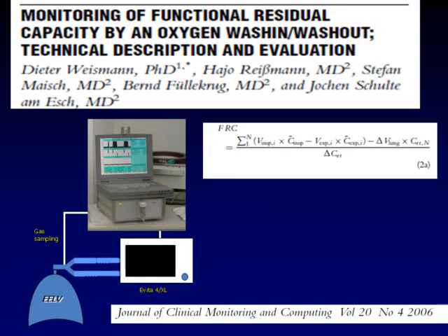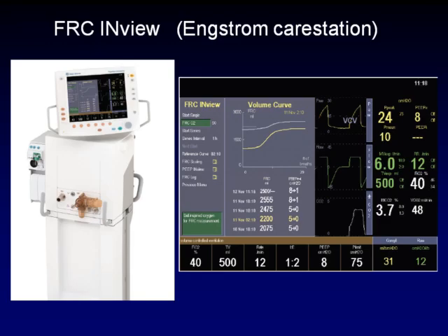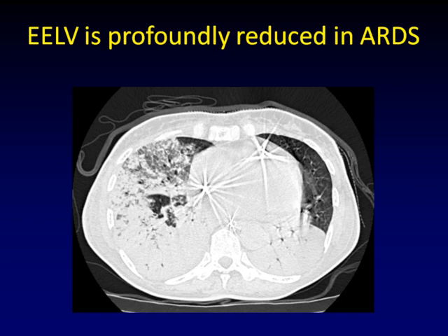We've been studying different machines to do this. Initially, we used this machine, which is an experimental machine. This one is the Engström Carestation. The principles are the same. The good part is that this is commercially available. It works.